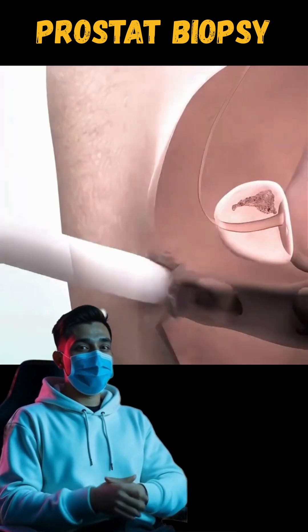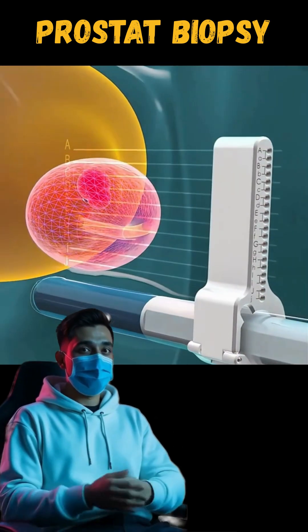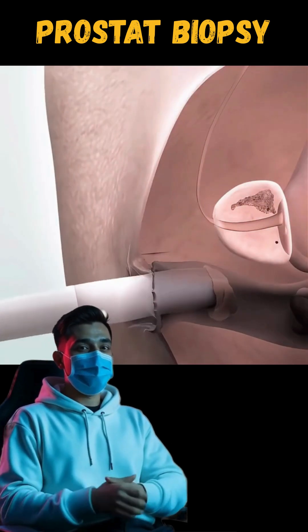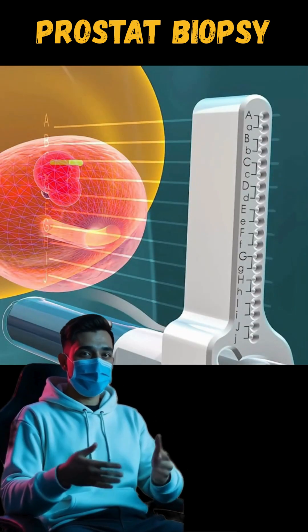An ultrasound probe is inserted into the rectum to guide the biopsy, which is done either through the skin behind the testicles, called the perineum, or directly through the rectum. A special grid is used to target different areas of the prostate.